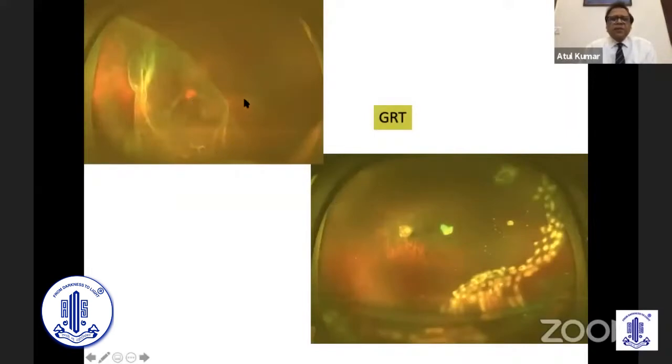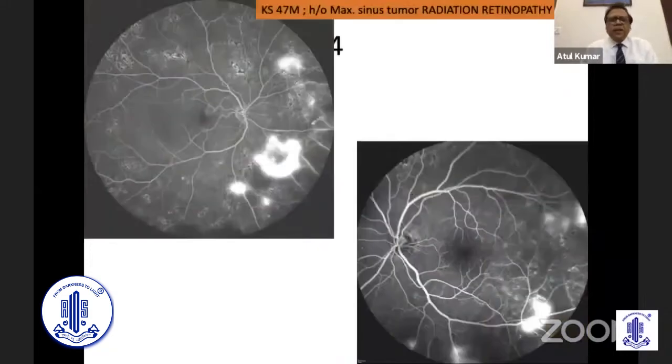And in all these cases of retinal detachment, especially giant tears, of course, indirect ophthalmoscopy is an excellent method of viewing. It's a subjective method of viewing. But you want to document the entire area of giant retinal dialysis or a tear. And afterwards, when you put in oil and have done the vitrectomy and everything, the laser marks, so you can see the extent of detachment. You can follow up this patient on indirect. At times, you can do the photographic examination.